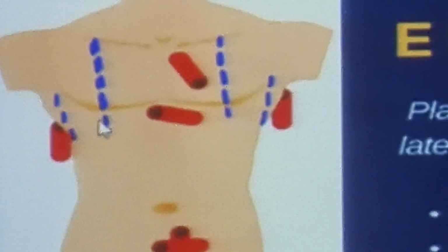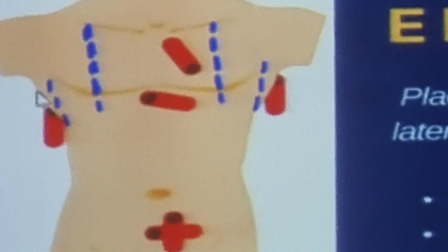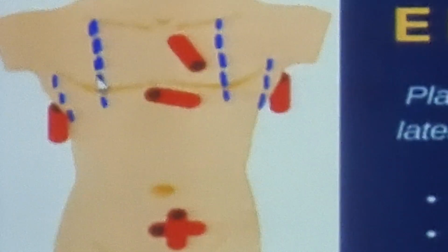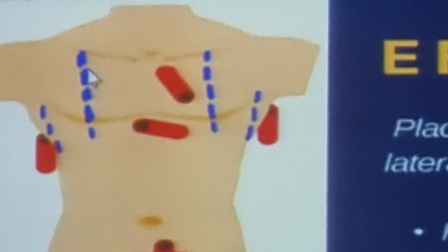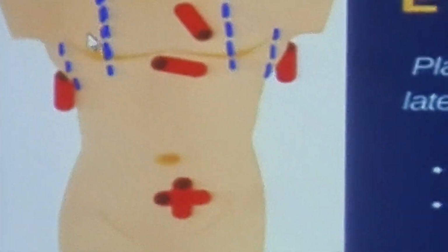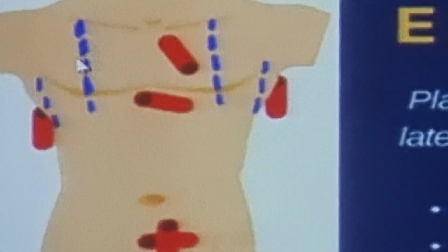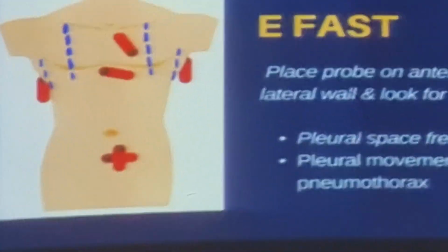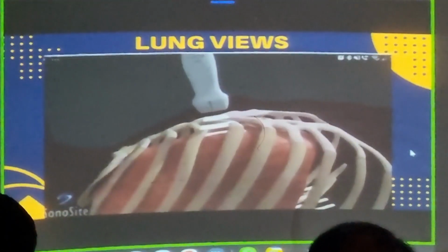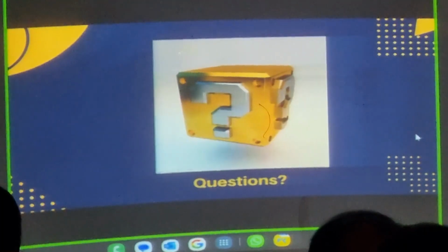I think the other important thing is you have to place the probe at certain positions. Front, anterior, lower part, lateral, axilla top, lateral, axilla, lower part of the chest. So two points here, and two points posteriorly, similar to the anterior plane we have to take.